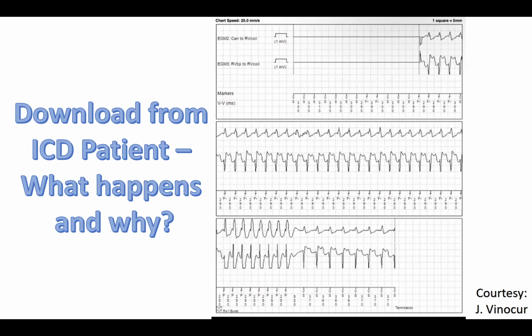And the goal was to determine that the device could both sense the arrhythmia and terminate the arrhythmia with an adequate safety margin between what it used to deliver the shock and the maximal output of the device. Not only would we test it in the operating room, but we would very often bring them back the next day and retest them. Part of the reason that we did that was two things. One, we didn't really know very much about defibrillators and what we could consider to be a safe safety margin.